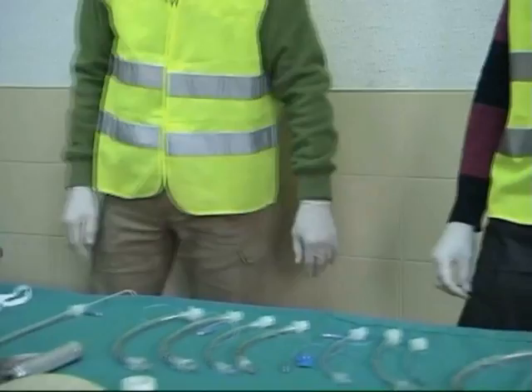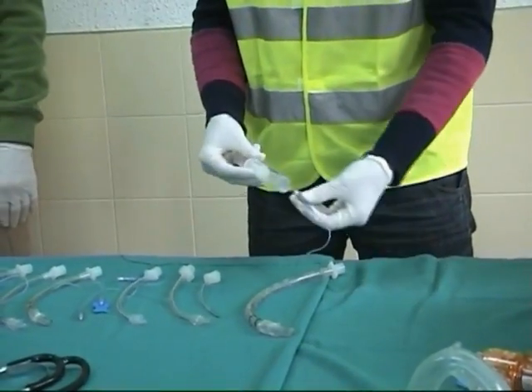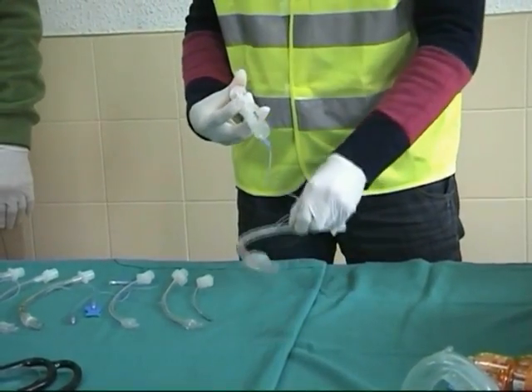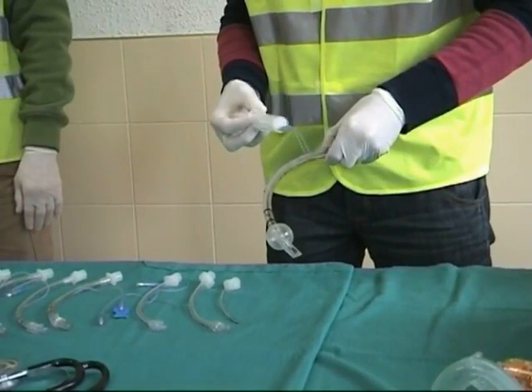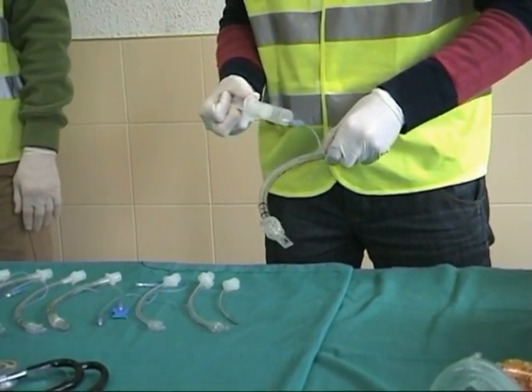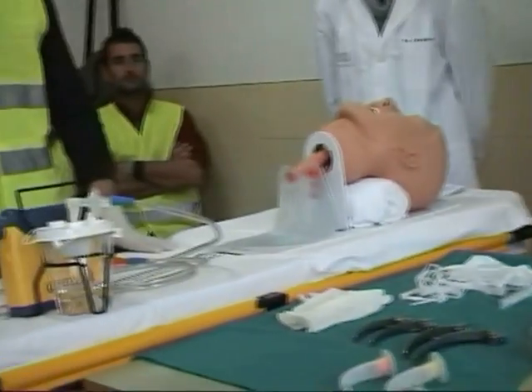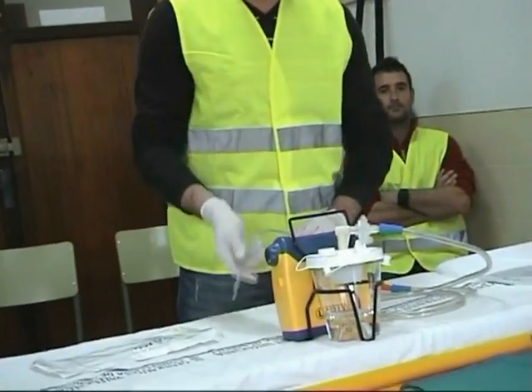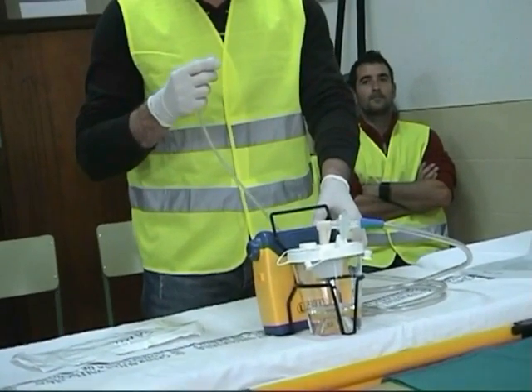To inflate the endotracheal balloon, searching for leaks. Make sure that the suction system is accessible and functioning.